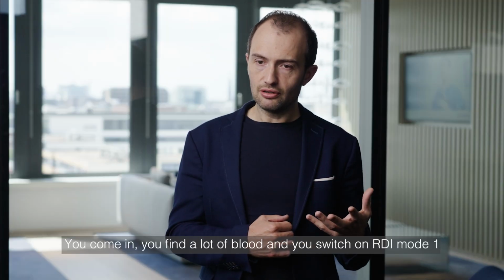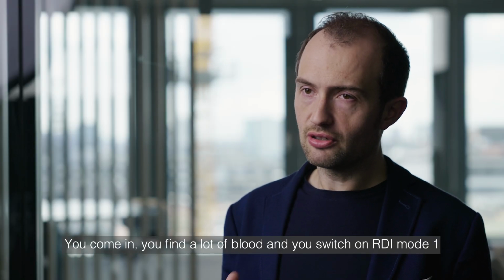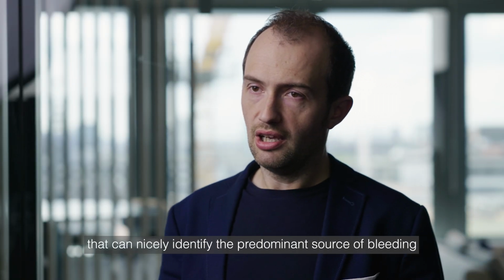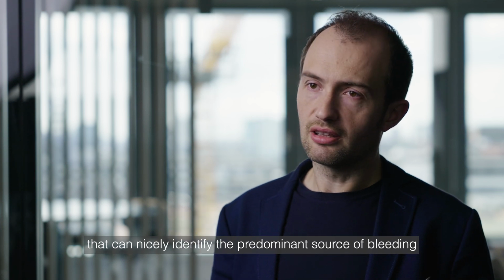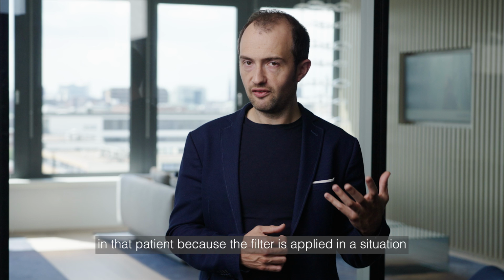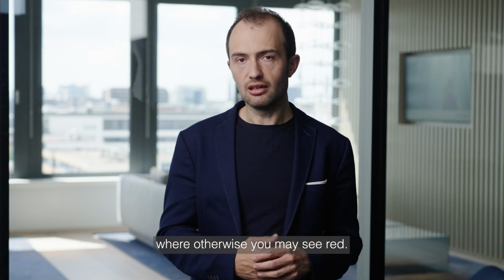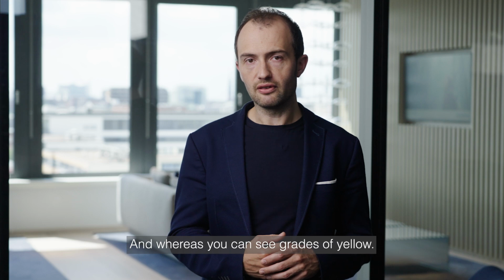So what do you do? You come in, you find a lot of blood, and you switch on RDI mode 1 that can nicely identify the predominant source of bleeding in that patient, because the filter is applied in a situation where otherwise you may see red, whereas you can see grades of yellow.